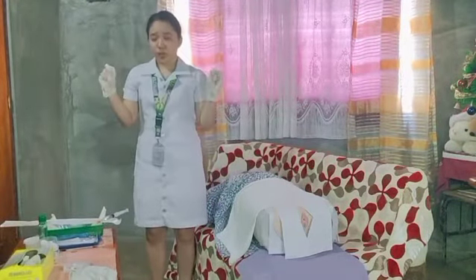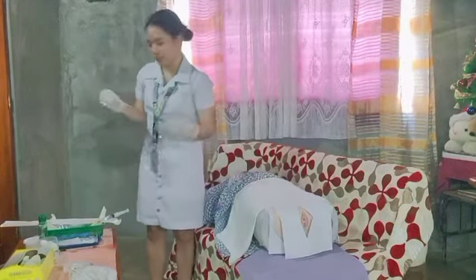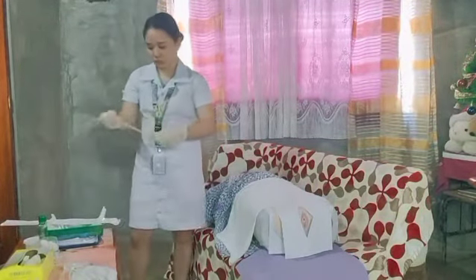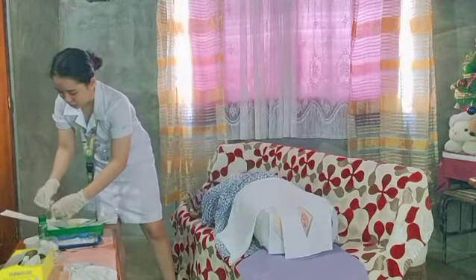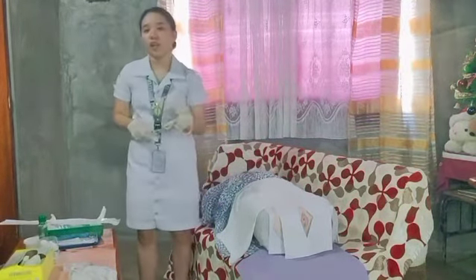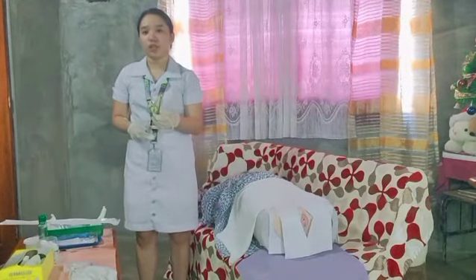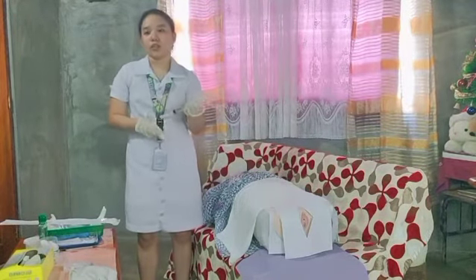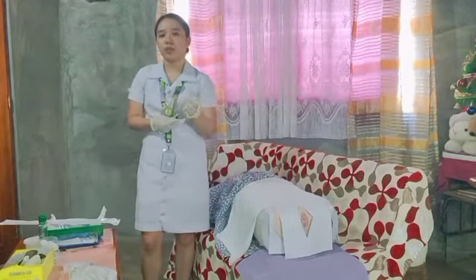So, now we are going to pick up the catheter with the dominant hand and roll it in the palm. Okay. So, the rationale, holding the catheter closer to the tip will help to control and manipulate the catheter during insertion. And also, we are now going to insert the catheter by asking the patient to bear down gently to help expose the urethral meatus.